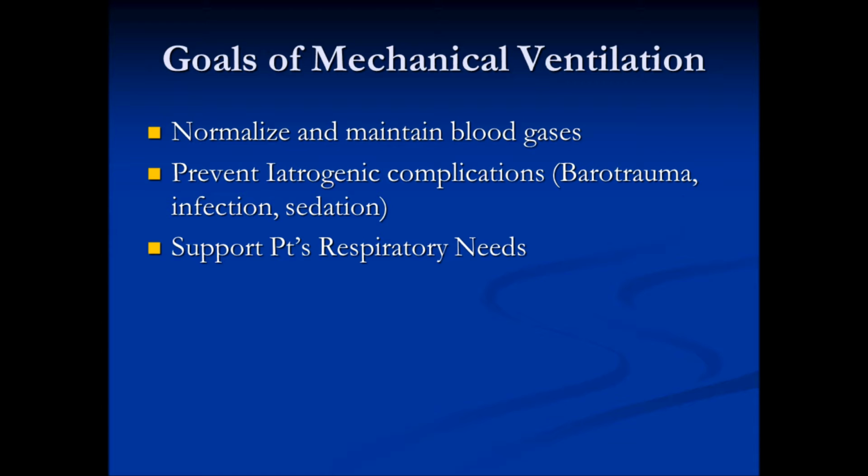So any of these or a combination of these may be the reason why we choose to put a patient on a vent, even neonates and pediatric patients.